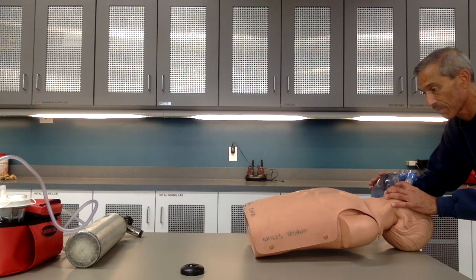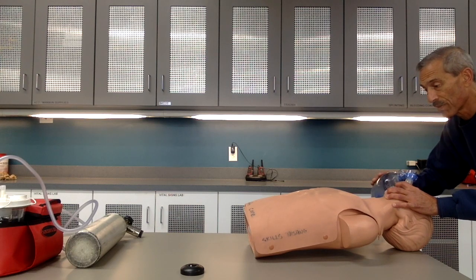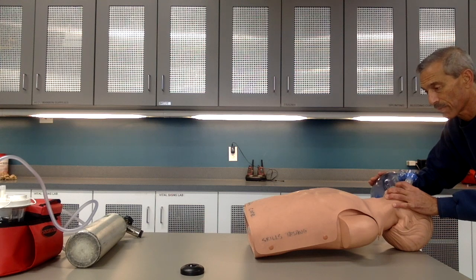Ventilate one every five seconds. One one thousand, two one thousand, three one thousand, four one thousand, five one thousand, one one thousand, two one thousand, three one thousand, four one thousand, five one thousand, one one thousand, two one thousand, three one thousand, four one thousand, five one thousand.